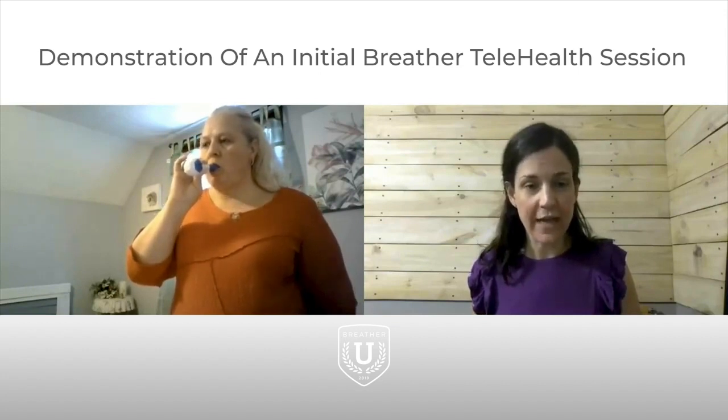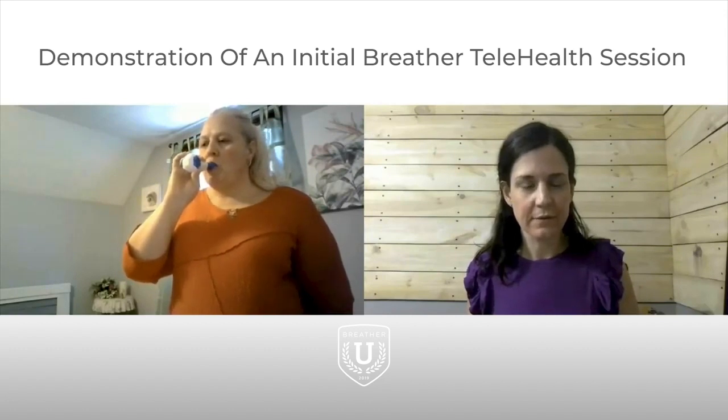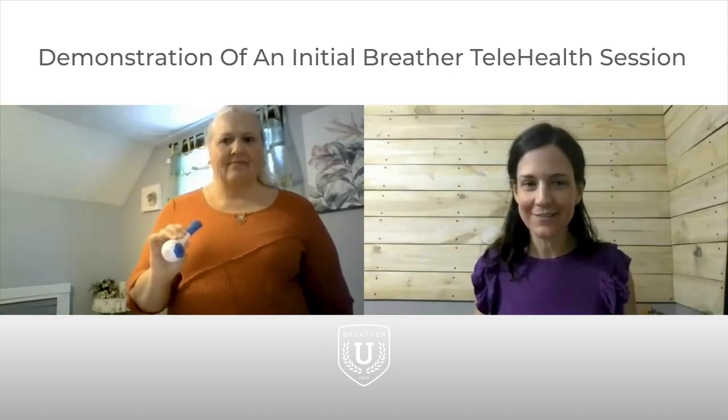Good. Make sure you get all that air out. Nice. How'd that feel? Good. Quick work. Are you lightheaded? Any lightheaded or shortness of breath? No. Kind of easy? Very easy.